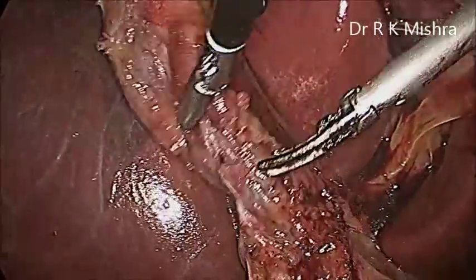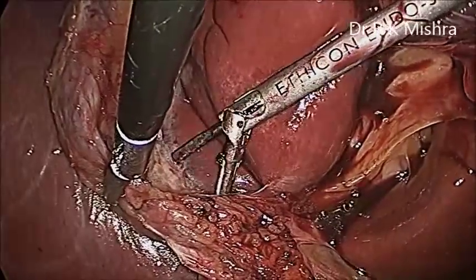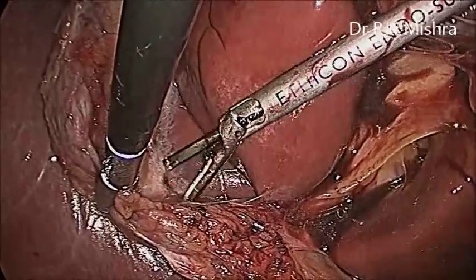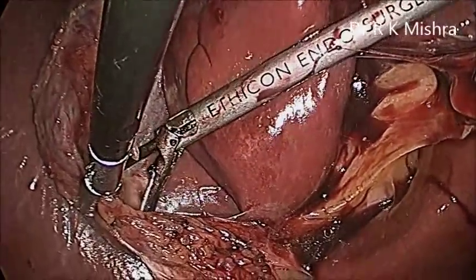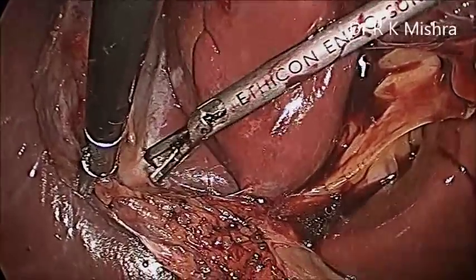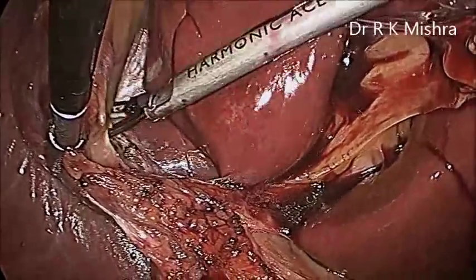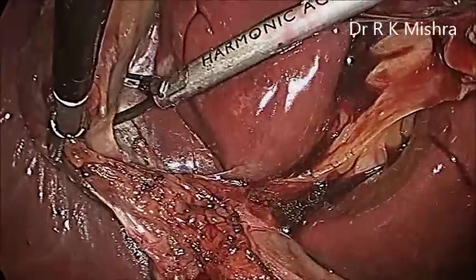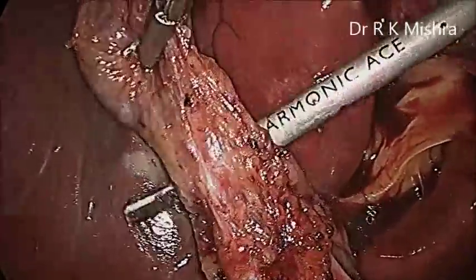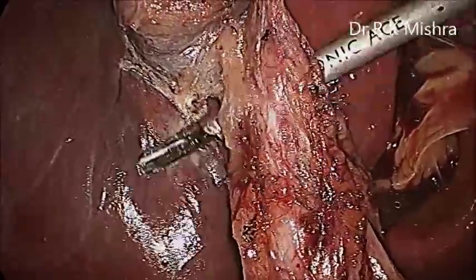Now again we have to give the anterolateral traction, and that will give you the exposure of the posterior peritoneum here. The window should be formed. Generally in my practice I prefer to make the posterior window first. What we see is the mouth of the elephant, Ganesha's head, and then we create it at the level of the body of the gallbladder. Now posteriorly, it is dissected completely, which you can see.